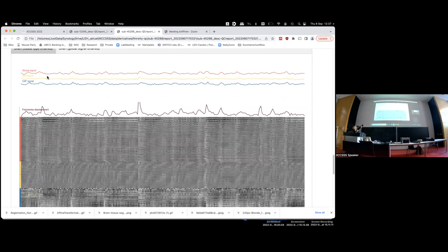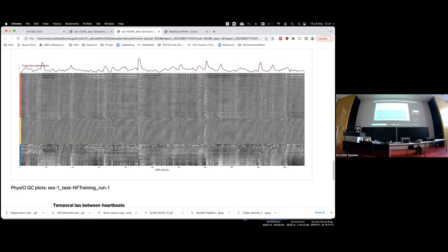And here you see an open end. And here you also see, ooh, there's a big contrast. So there's a movement going on, so that a participant moved the head more than 3 millimeters. And this would then be taken out of the analysis because of this outlier detection. And here you see, right, this is a really good participant, was lying very still. So it's rather smooth. You have one edge here, and everything looks really nice.